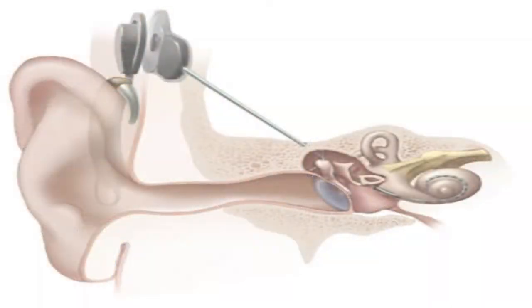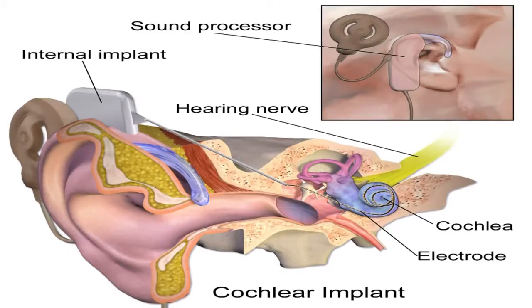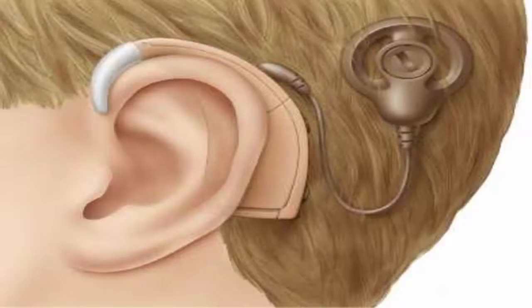answers. Okay. So today we're talking about cochlear implants. Tell us a little bit about those for people who might not know what they are. How do they work? Yeah, a cochlear implant is very different than a hearing aid in the way that it provides hearing. A hearing aid has a microphone which brings in the sound, it processes the sound, and then it amplifies it into the ear canal. For a hearing aid to work, the hair cells of the inner ear must be able to receive that sound and transmit it to the nerves for hearing.